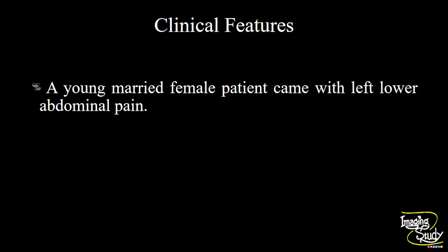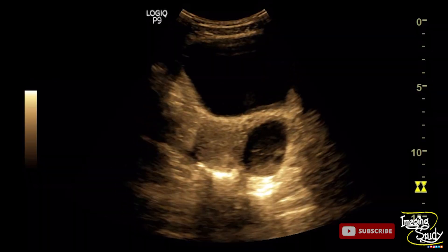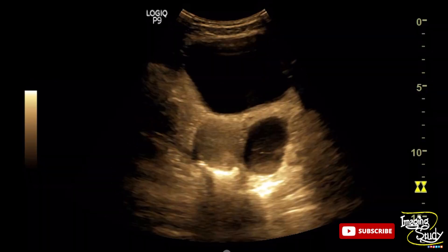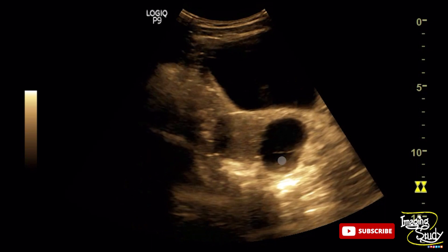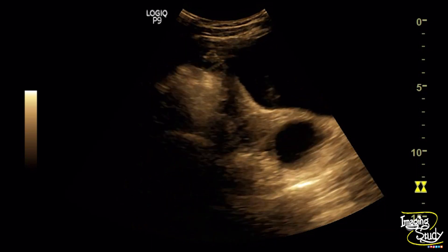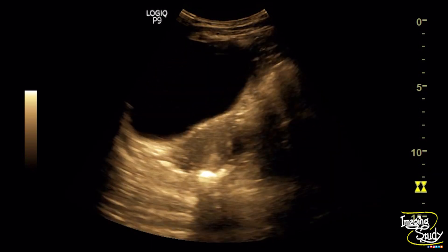A young married female patient came with left lower abdominal pain. On ultrasound, you can see a well-defined complex cystic structure with internal solid components and reticular pattern noted at the left adnexal region.